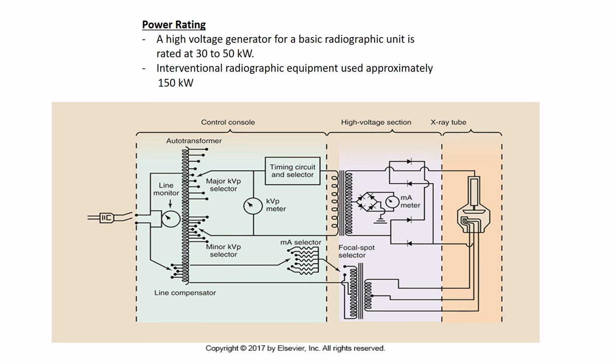Notice the kVp meter. Notice the timing circuit. Notice the step-up transformer. On the secondary side of the step-up transformer, connected right in the middle, is our mA meter that's grounded. Then we have our rectifier. That's the 4 diodes there. And then we have our tube.